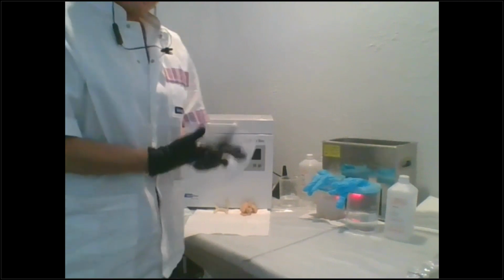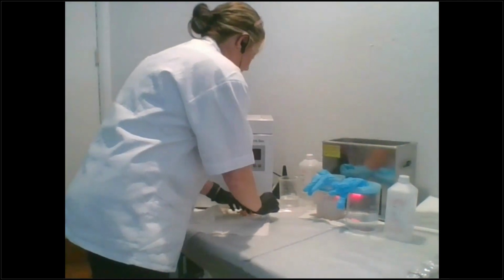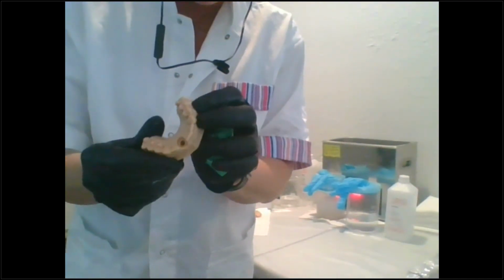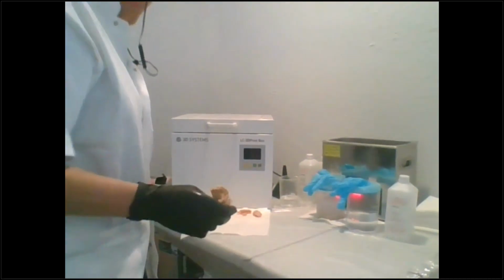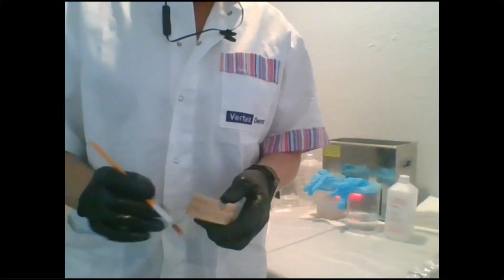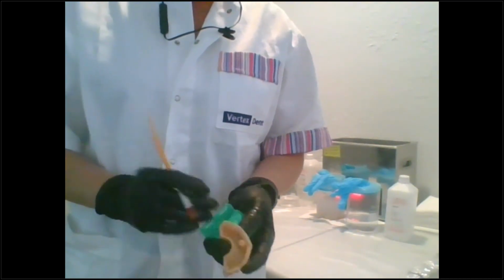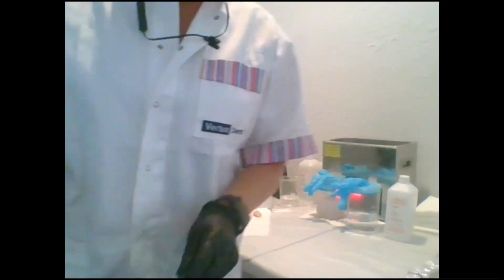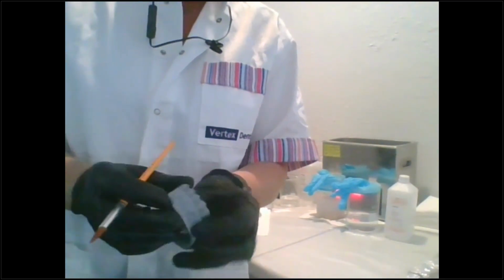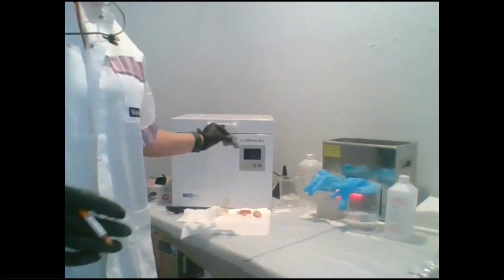You can put your lab analogs in before you do your cure. So what you can do is, you can see that I have this guy here. You can just use a little brush like this, and you can use some of your resin if you're not going to reuse your lab analog. And you can just put your analog in, and I have one that I already did. And I just put a little resin in down here to secure it, just like you would do with some glue, and then cure it in the cure oven like that.